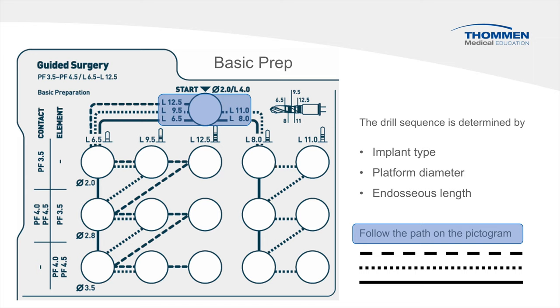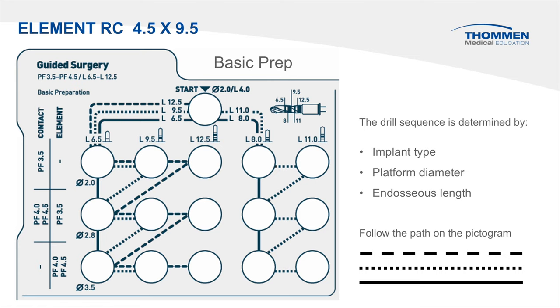The path can go either left or right and follows one of three lines: dashed, dotted, or solid. We will start with an element RC 4.5 by 9.5 as a drilling sequence example. We begin by locating the implant type — element — then locate the platform diameter, 4.5. The final reference is the length, which is 9.5.